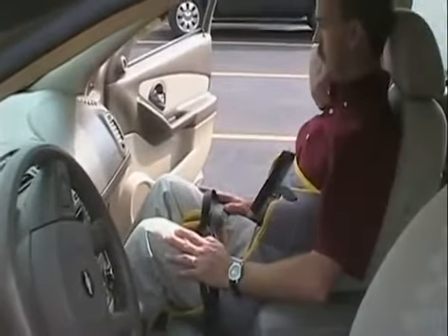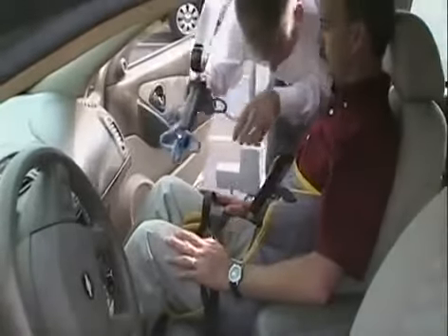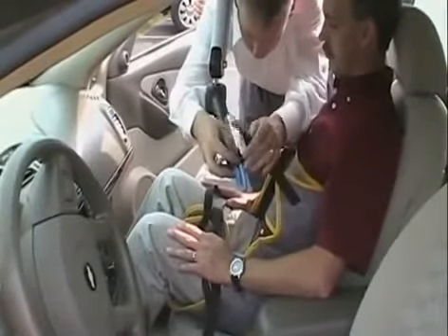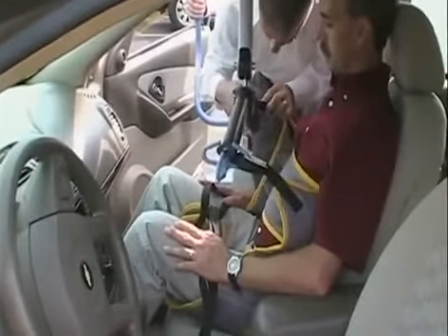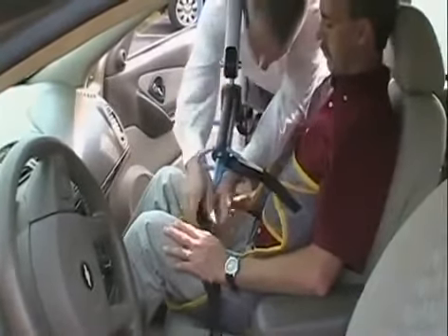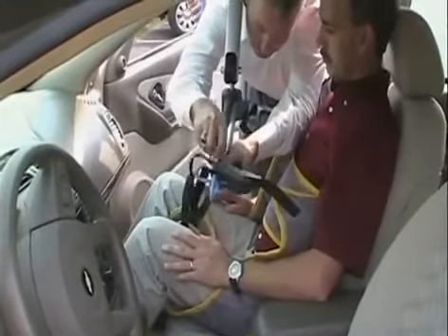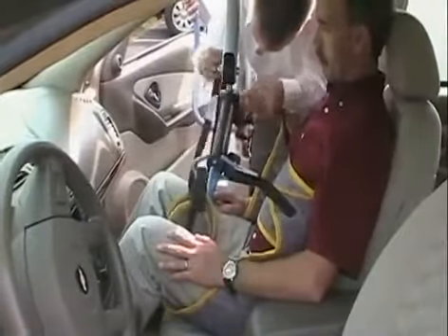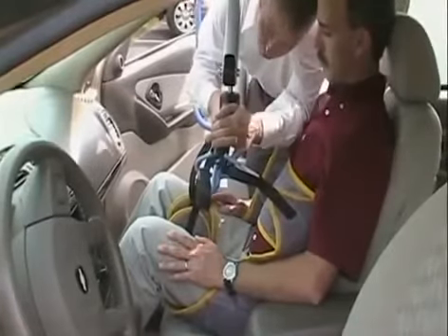Now I'm going to bring the equipment up. I'm going to bring the equipment up and we're going to make connections with those sling straps. I'm going to use the two that are connected to your shoulder section and place them on the hooks closest to you. Then I'm going to use the two that are on your leg section and put them on the hooks that are furthest away from you. There are two extra hooks, but we're not going to use those. After I've made that connection, we're going to go ahead and start to move the lifter out.